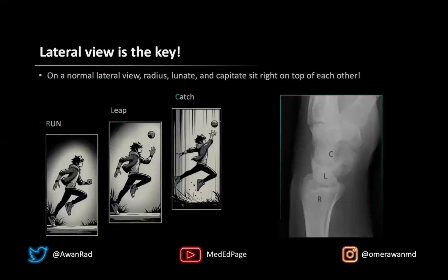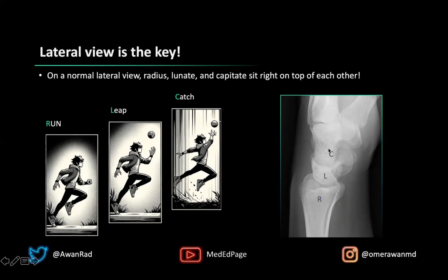Looking at a normal lateral view, the radius, the lunate, and the capitate form a nice straight line — they sit right on top of each other. The lunate is that cup-shaped bone sitting on top of the radius, and the capitate sits right on top of the lunate. A mnemonic for this is 'run, leap, catch' — radius, lunate, capitate. When that alignment doesn't happen, you have some element of carpal malalignment.